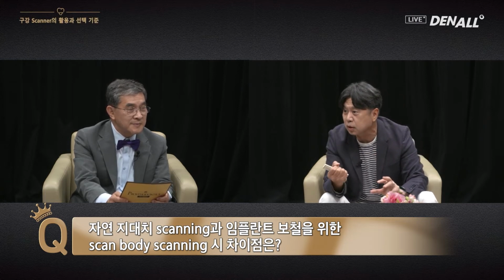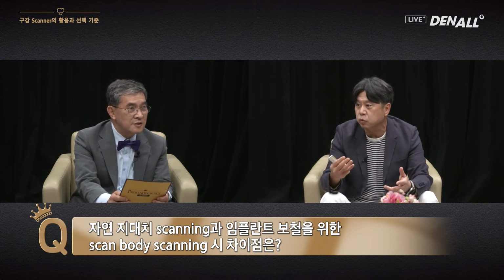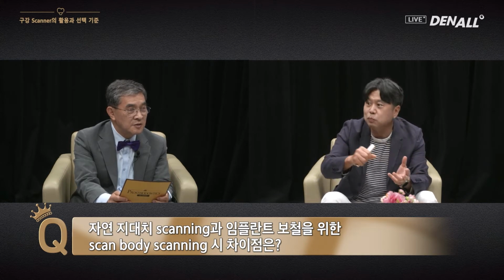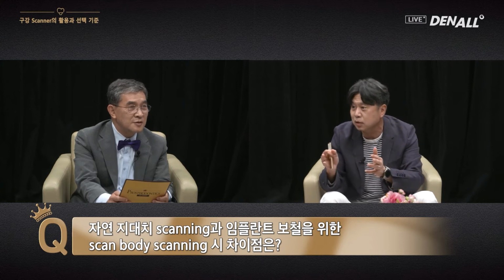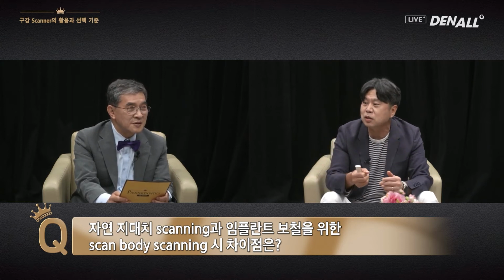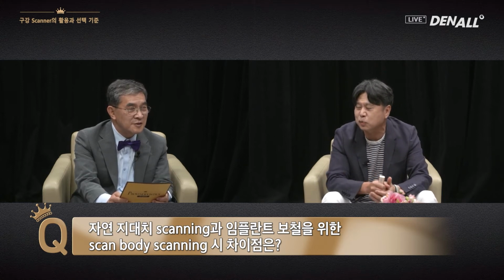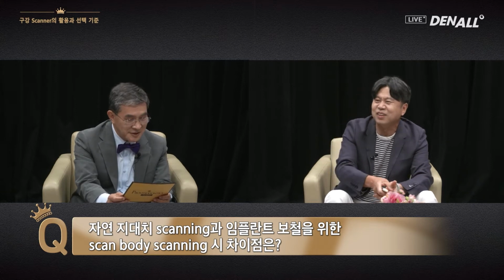If you take the impression in an analog way, it is much more difficult to take the impression of an implant compared to the natural tooth. Digitally, scanning an implant is much easier. For analog impression taking, a natural tooth is much easier than an implant. So IOS is optimized for implant treatment. I will elaborate on that later.